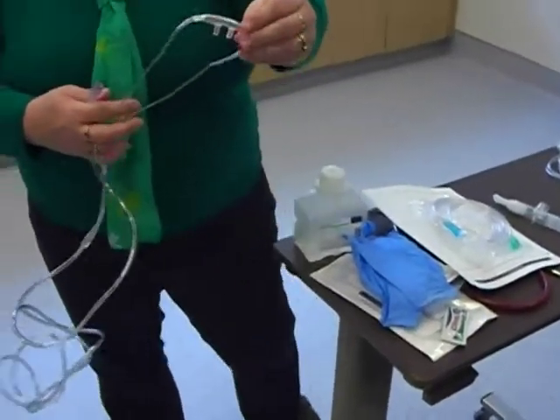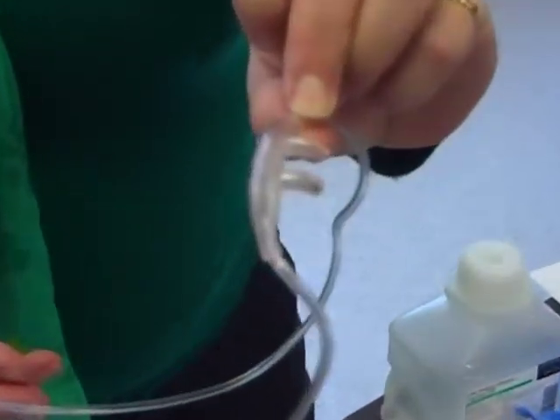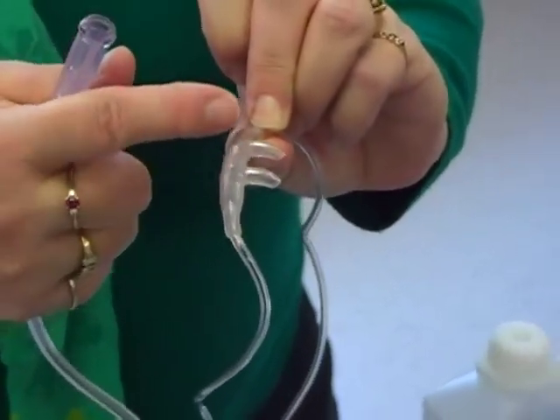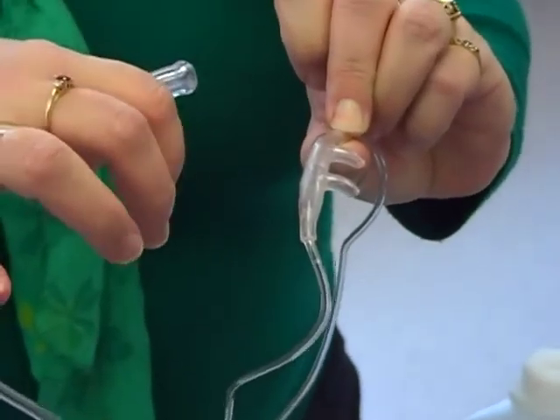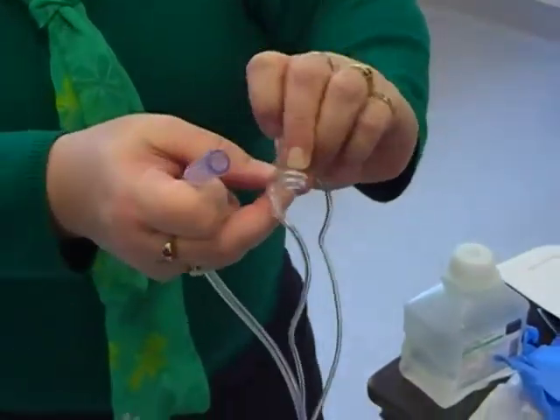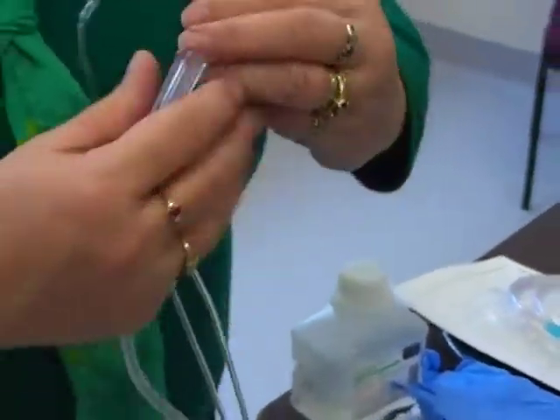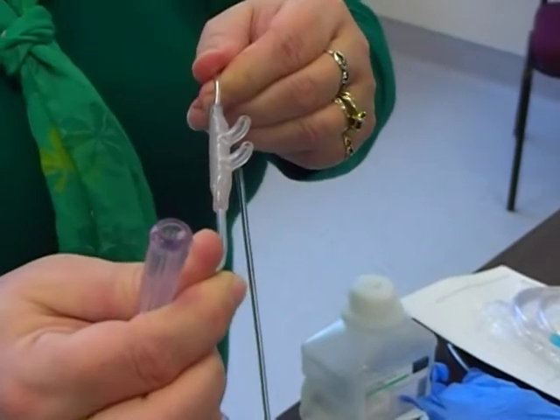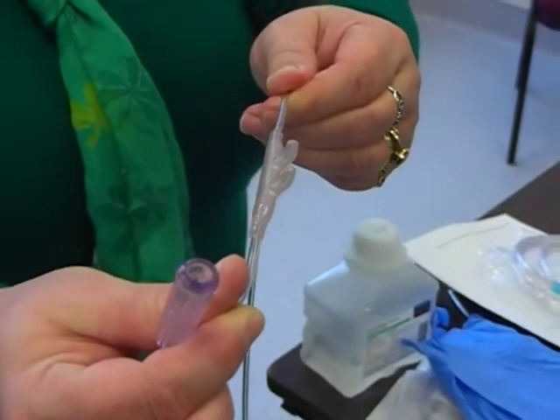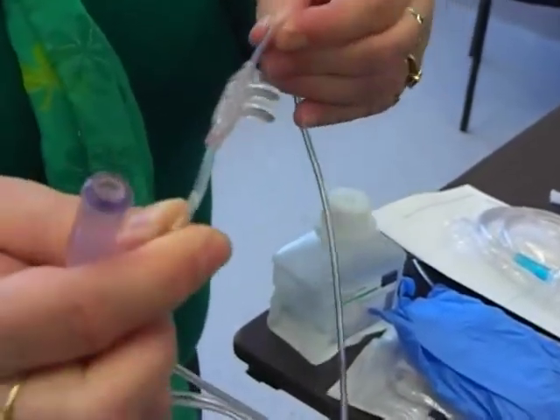This is what we call a nasal cannula, and this is what goes into the nose. Now I want you to notice these spikes — they look like snake fangs, right? We want those prongs facing down towards the lung. We don't want them up like this, because what's happening is the oxygen is going up to their brain. The brain needs oxygen after the lungs have processed it, so we want to make sure that the prongs are going down into the lungs.